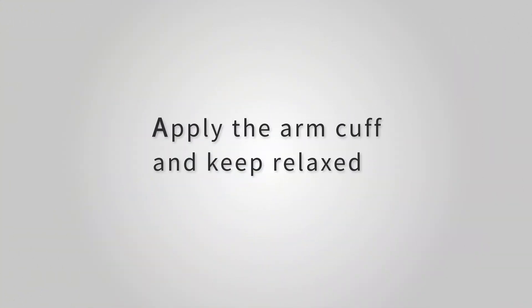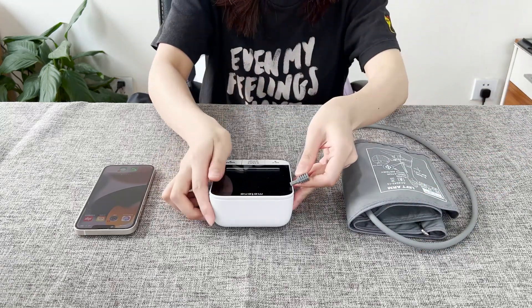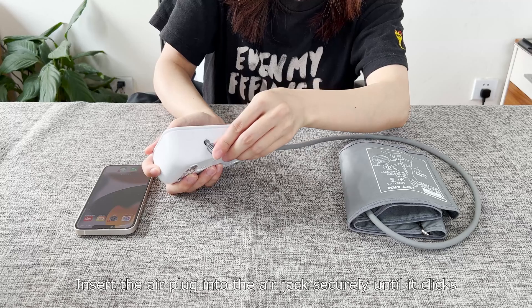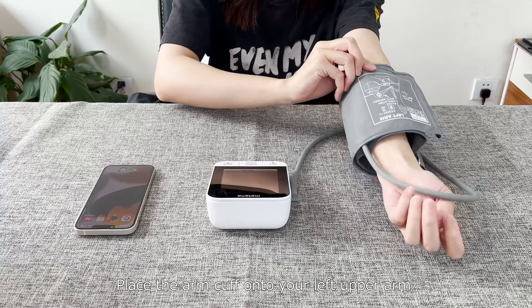Apply the arm cuff and keep relaxed. Insert the air plug into the air jack securely until it clicks. Place the arm cuff onto your left upper arm.